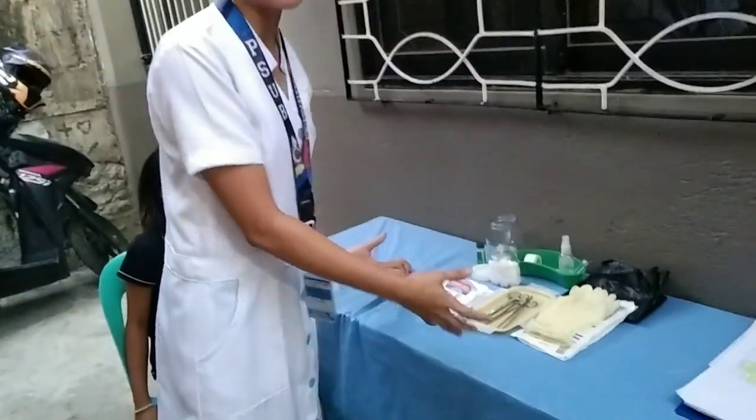Okay, so for the planning, the specific orders for obtaining a wound drainage specimen for culture, and then whether the wound should be cleaned before taking the specimen and whether the site from which the specimen will be taken has been specified. Okay, and then I have also gathered the equipment, so these are the equipment that I need to use. Then for the implementation or preparation, check the doctor's order.